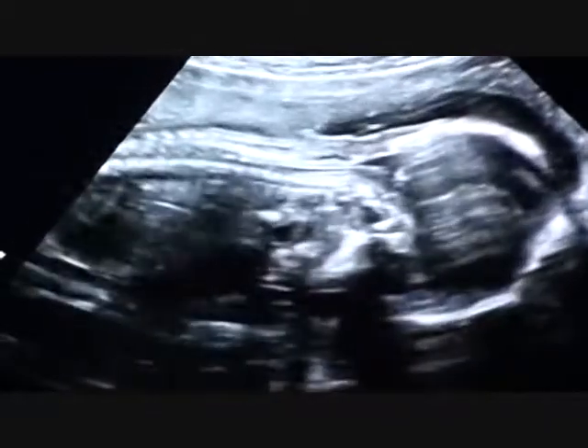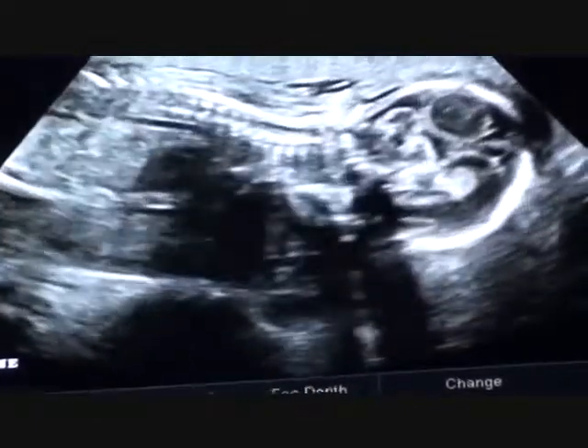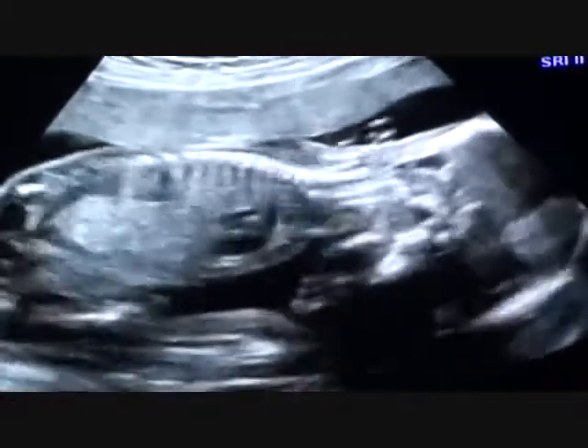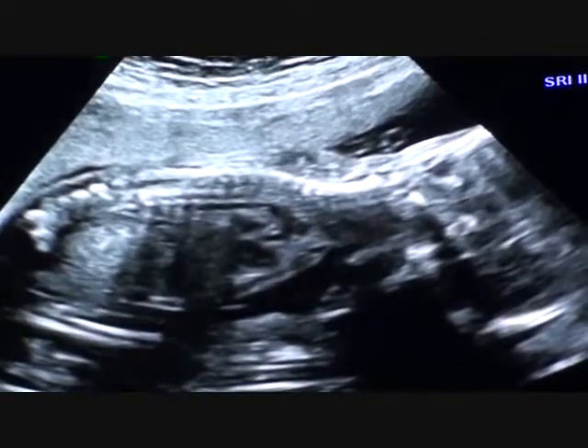I like to get the C-spine a little better. See how we're waiting for baby to turn that head. I'm going to get this all connected back there. I can see baby's aorta. The aorta is the largest artery in the body — a little black line back here.